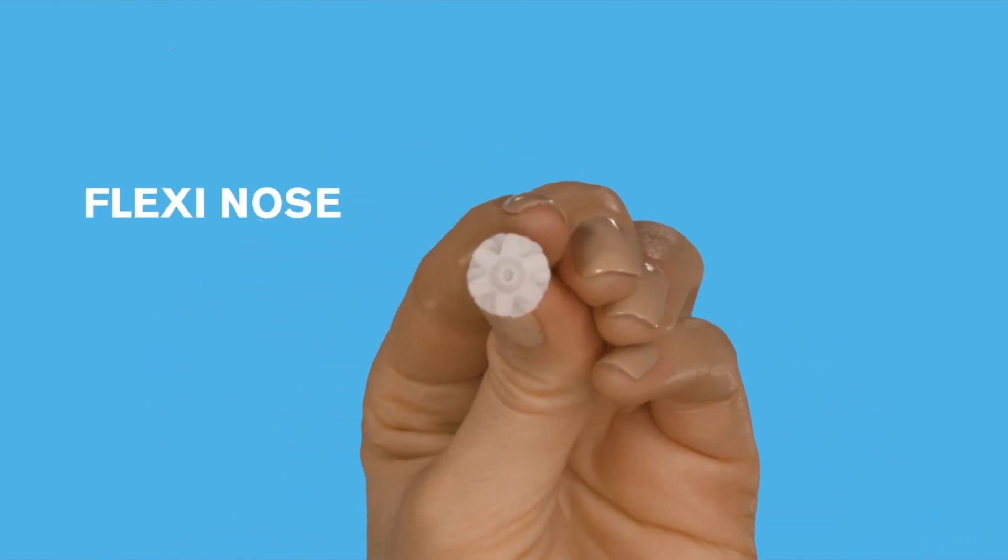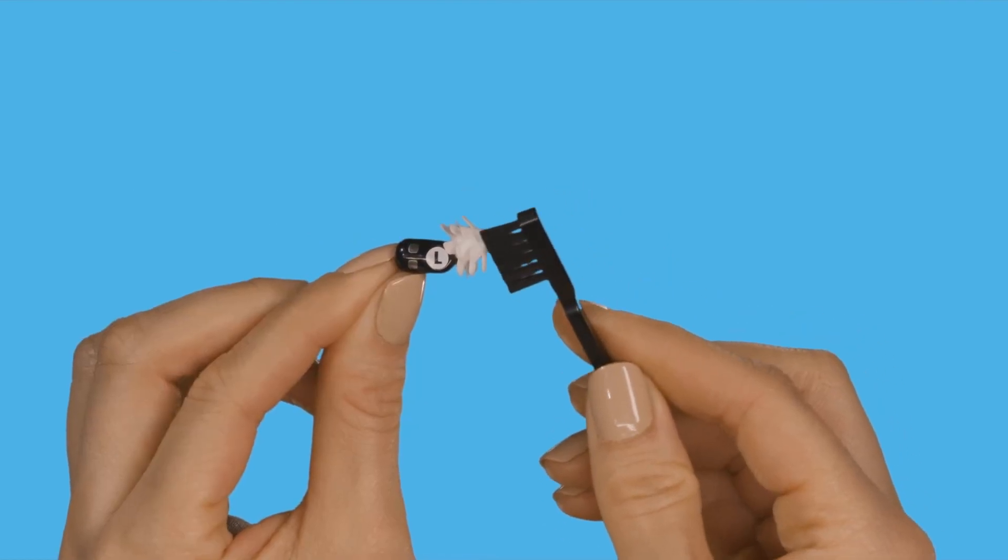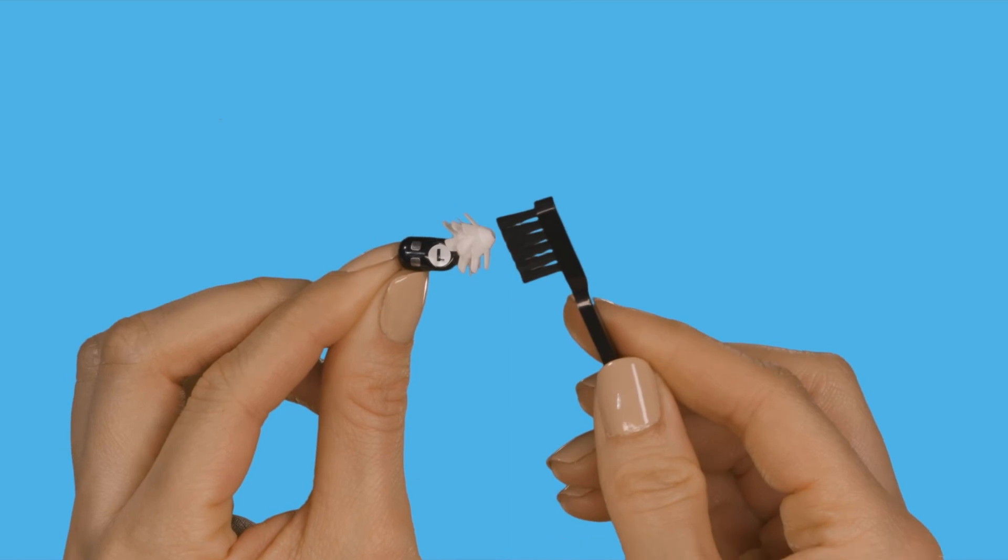Visually look at the tip of the flexi. You should be able to see the white tip with small holes. Brush out the nose of the flexi, brushing the wax away from the device.